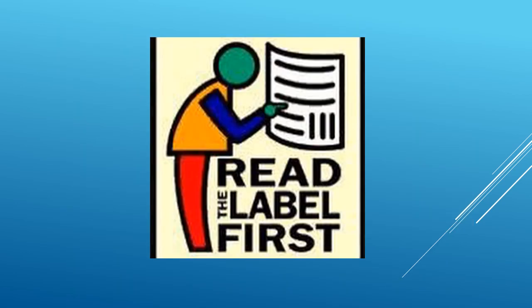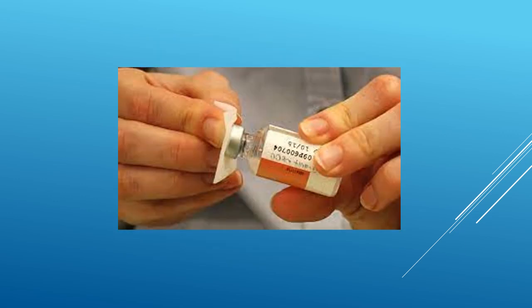Also, make it a habit to read the label. Most mishaps which have occurred are because you have given a wrong drug instead of contrast to the patient. Whatever adverse event has occurred is not because of contrast, but because you gave the wrong drug. Read the label before you give it. Ensure that you are giving the right drug, the contrast. You can wipe the rubber stopper with an alcohol swab.